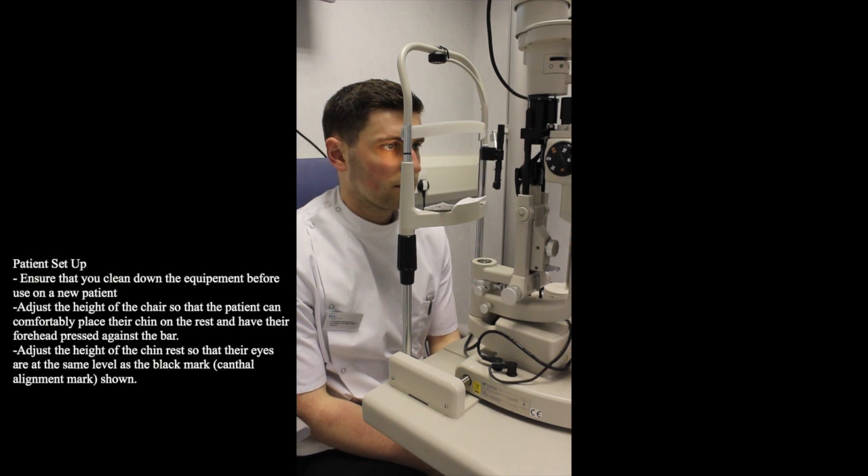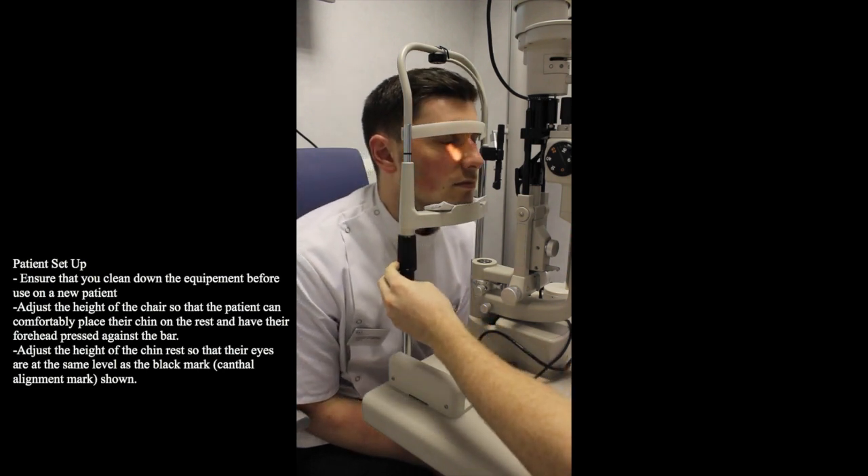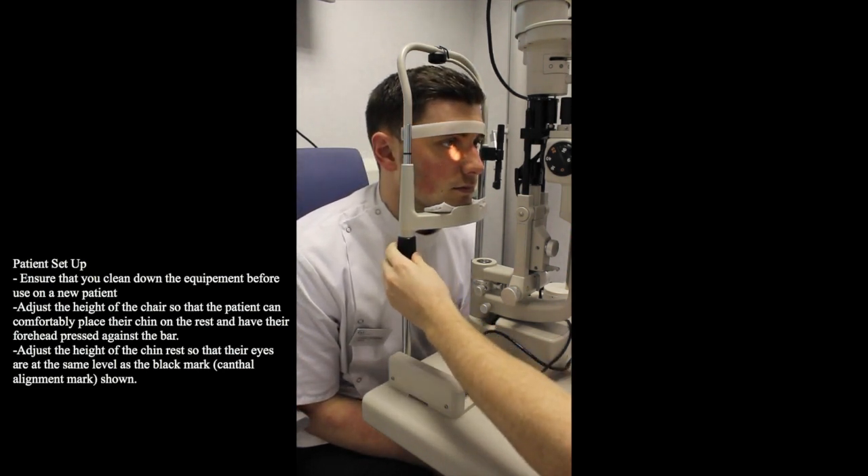Before we begin any slit lamp investigations, it is important that the patient is set up correctly. This can be done by adjusting the height of the chair and chin rest to appropriate heights, ensuring the patient is comfortable and the patient's eye is level with the black marker shown here.